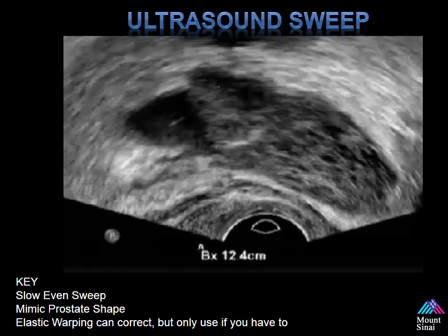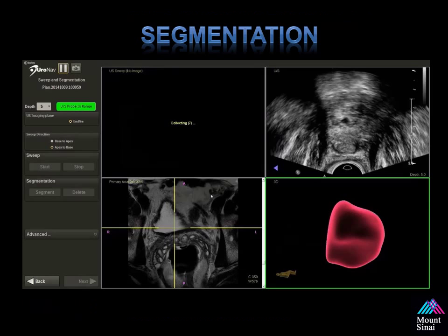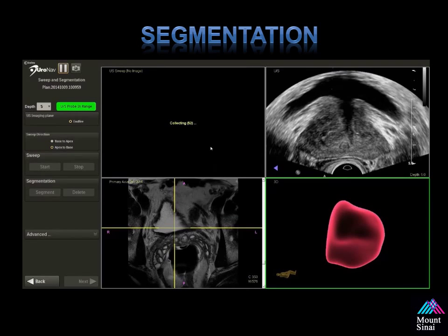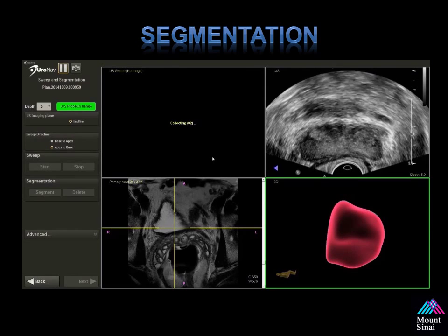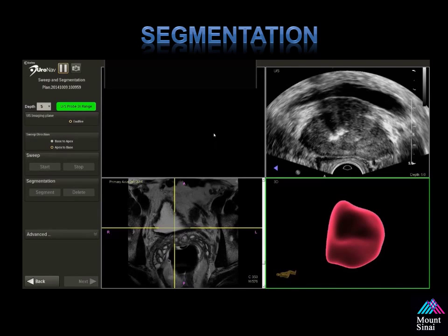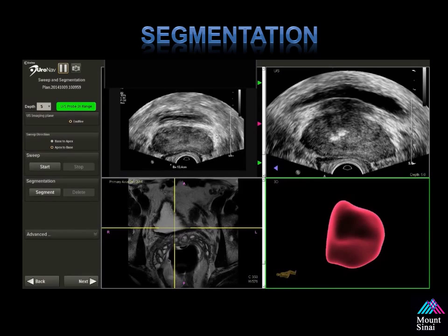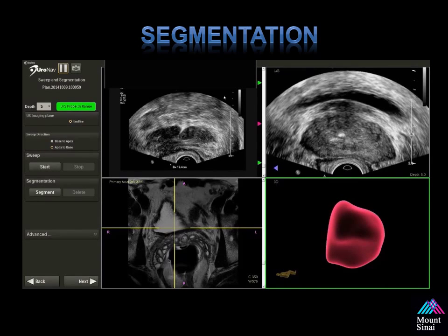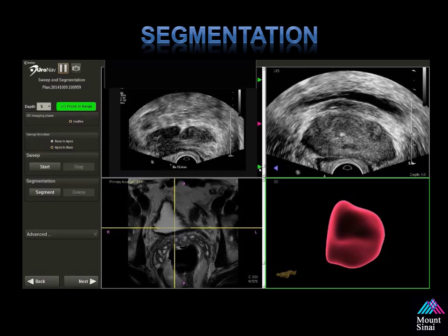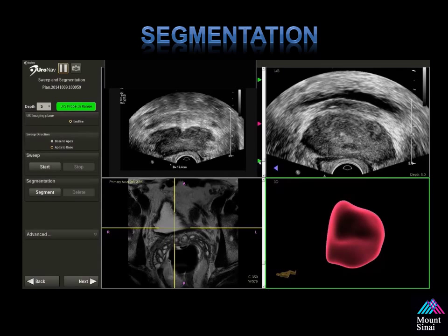Again, it's a slow, even sweep. Once the sweep has been performed, the data set is collected and then the computer is able to surface render or segment it. Reviewing the images in the upper left-hand corner, we set the apical slice, we set the slice of the base, and place the orange arrow in the middle of the prostate. This creates our axis.